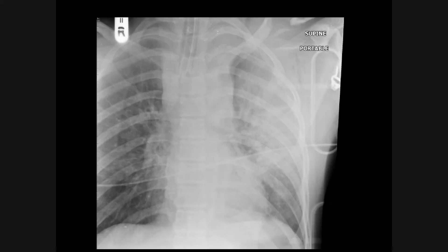This young man has been involved in a road traffic accident. As you can clearly see, there is widening of the mediastinum, there is loss of the aortic knuckle, and in the left apex there is the so-called apical pleural cap.